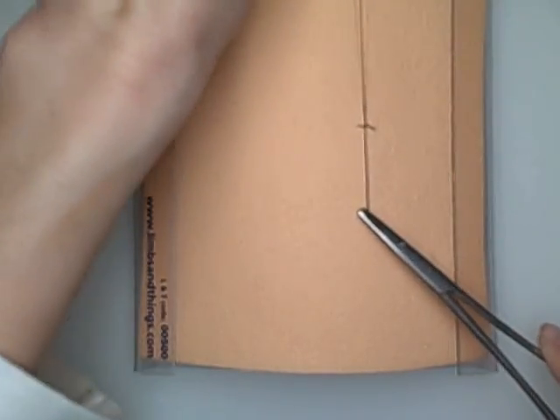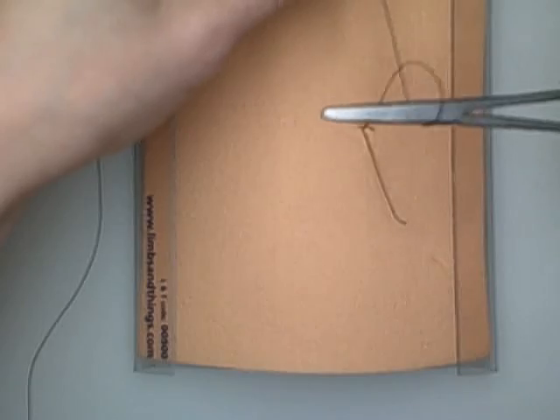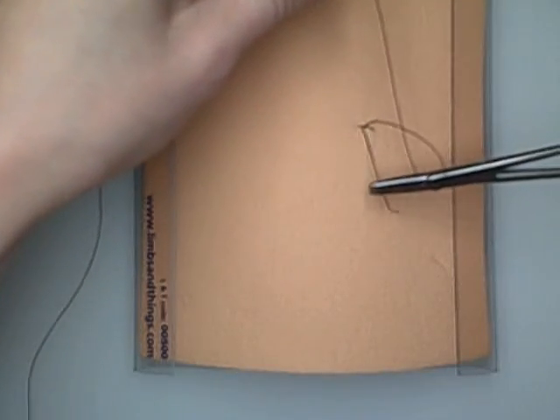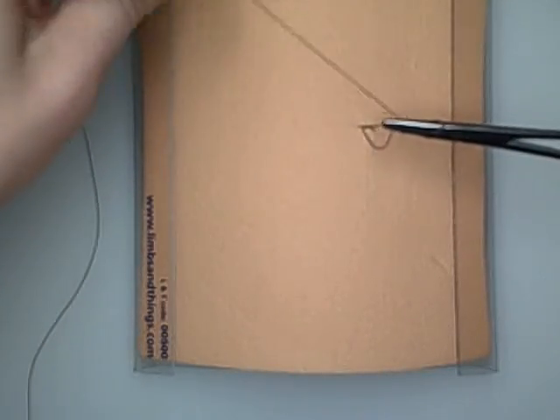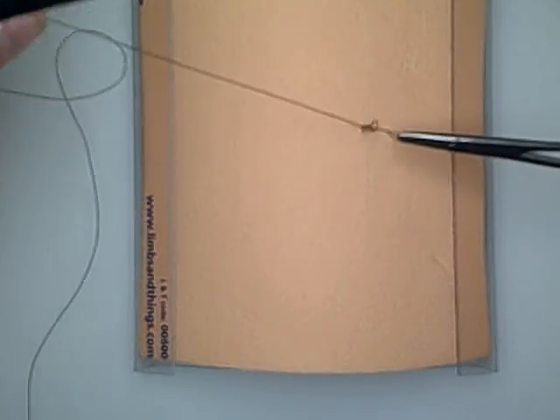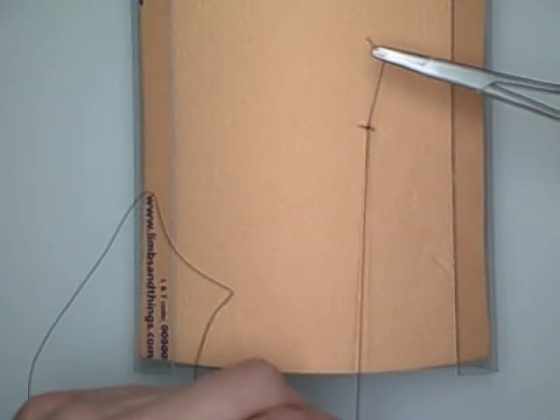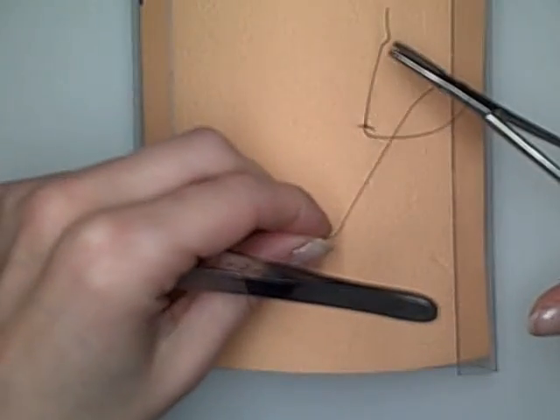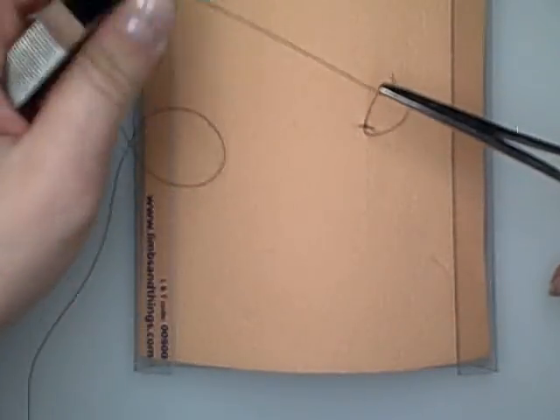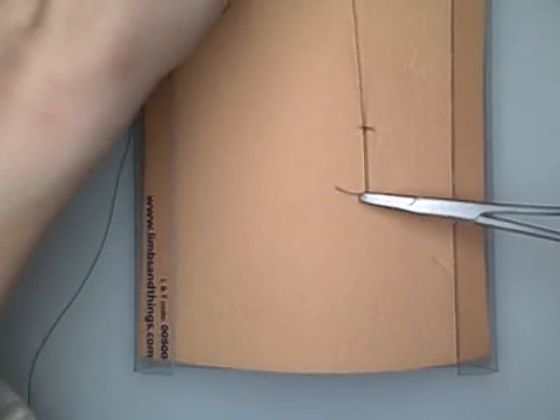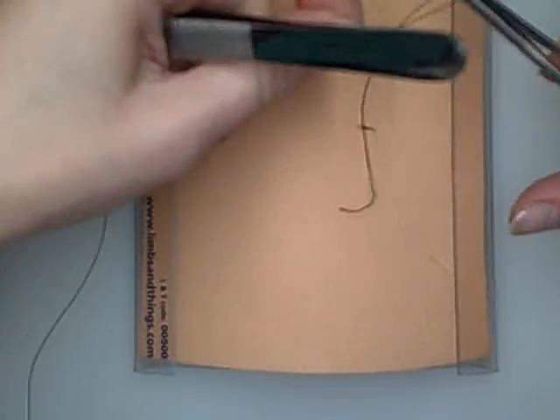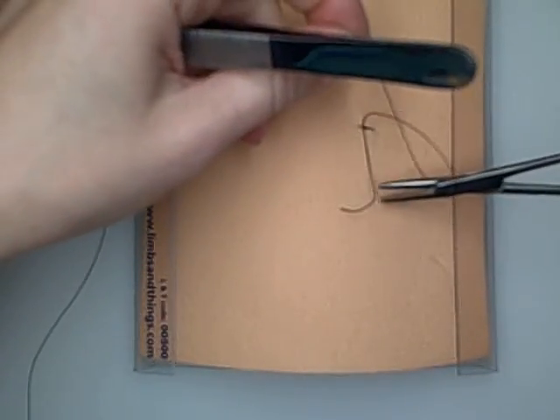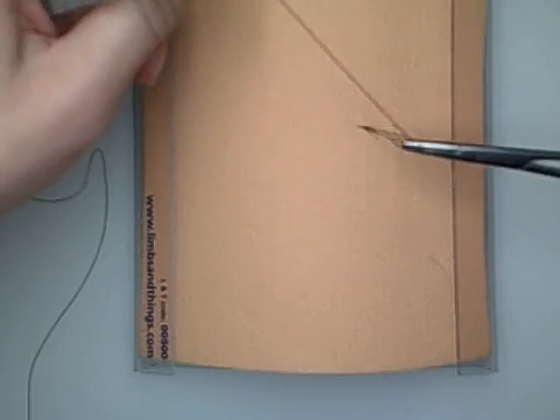Whenever you do instrument ties it's always important to kind of flatten out the knot. And usually you want to put about four throws maybe.